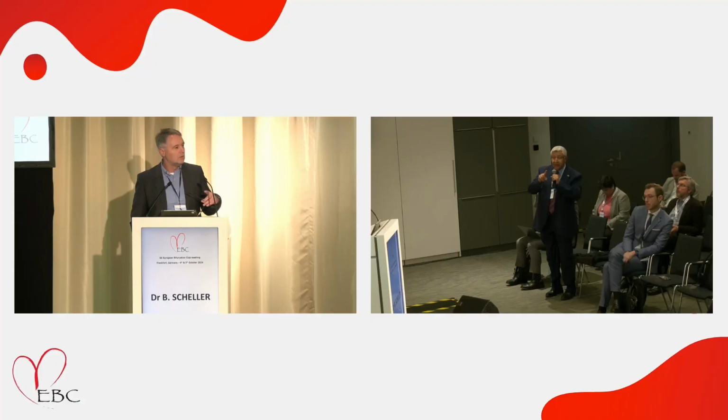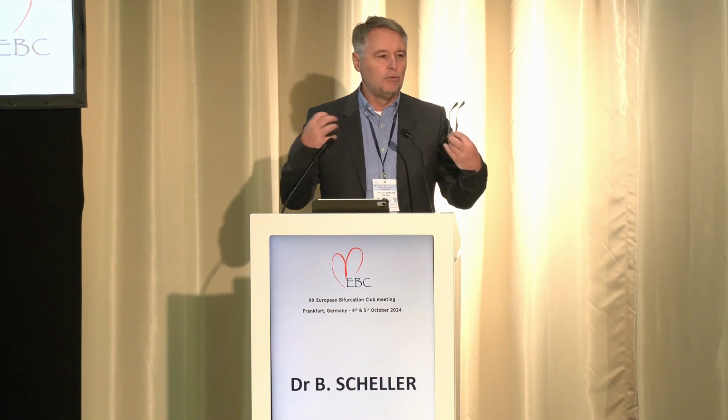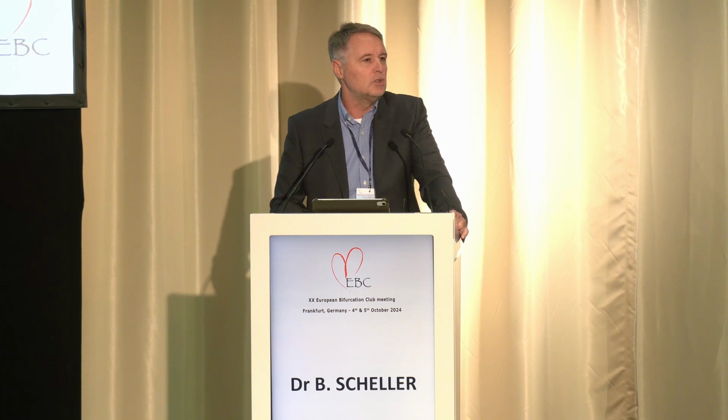You mean for in-stent restenosis? But the main vessel and its side branch both are having restenosis, and then you need a balloon for each one. In-stent? In-stent, yes. So for DCB, the basic rule is don't do kissing DCB. This makes no sense because you lose track of the first one when positioning the second one, and you do not have full contact to the vessel wall with the balloons because they kiss each other. This means this is a sequential approach.